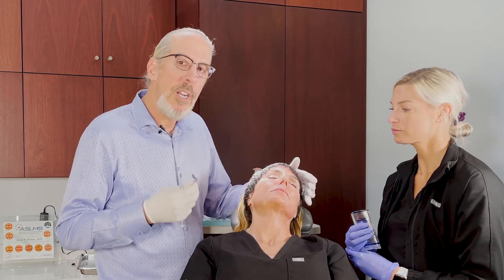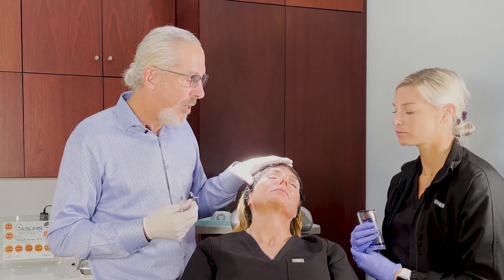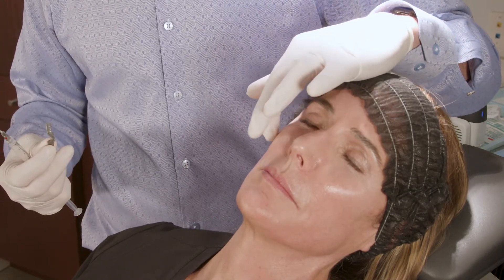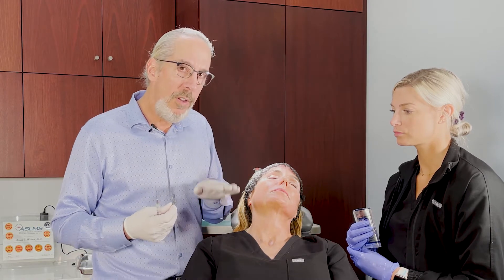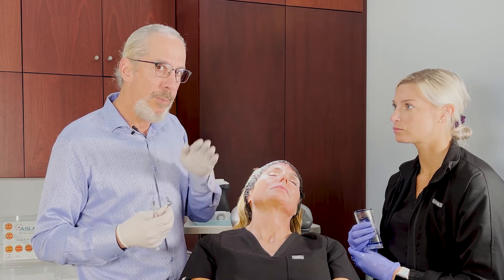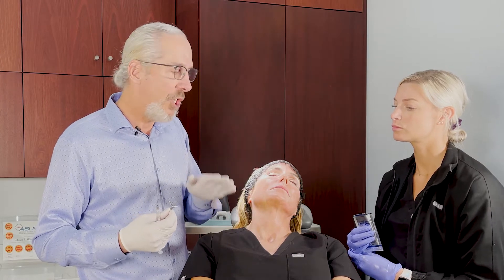Now we're going to do the prezygomatic space. The prezygomatic space is bounded by the orbital retaining ligament superiorly, the zygomatic cutaneous ligament inferiorly, the SMAS superficially, and the periosteum deep. If you inject in the prezygomatic space, the likelihood of having malar edema is significantly decreased because you're below the superficial lymphatic chains.